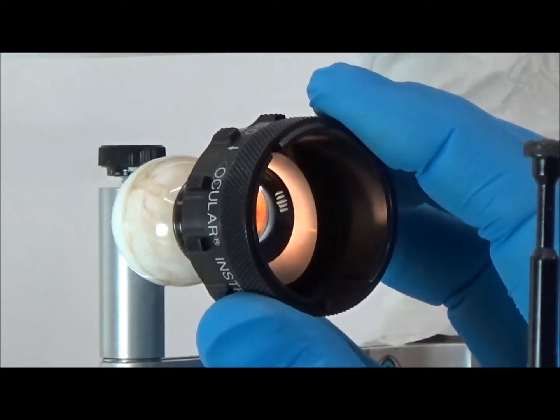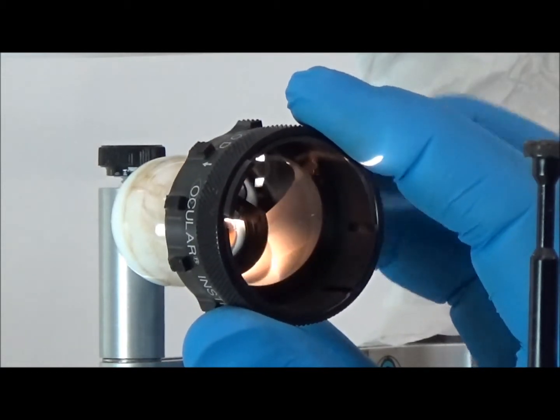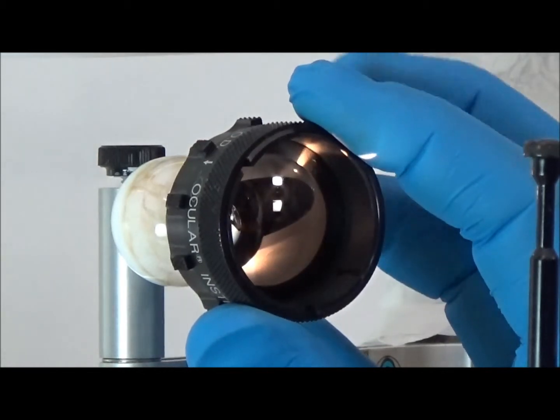When desired, the lens can be easily rotated by moving the lens tabs from one indexing position to the next with the middle finger as shown.